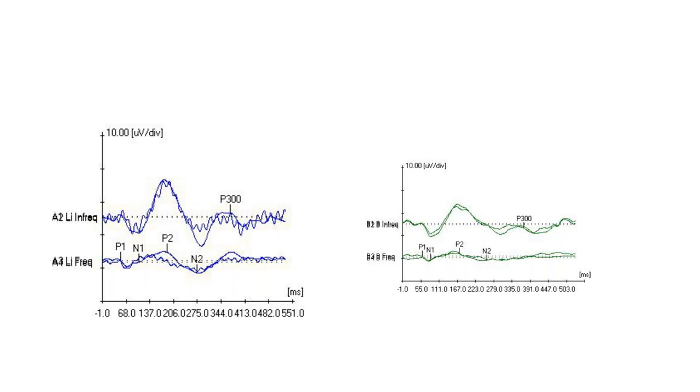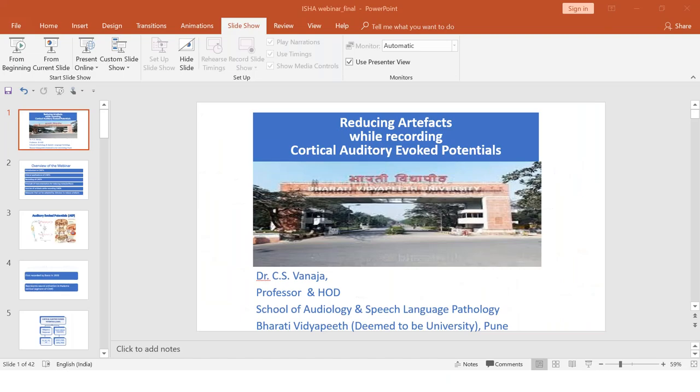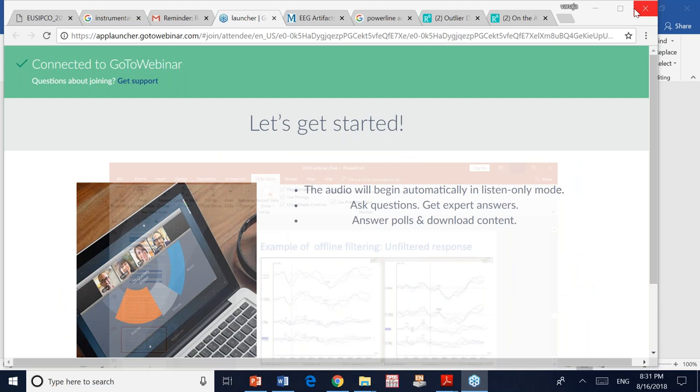Dr. Chandan has one more question, ma'am. The question goes like this: would the waveforms look different for different speech stimuli? Yes, they do look different. I don't have the same concept, but the latencies and the amplitude do vary slightly, so you have a different waveform. Can I move out of this slide and look into my laptop to get a waveform for Chandan?